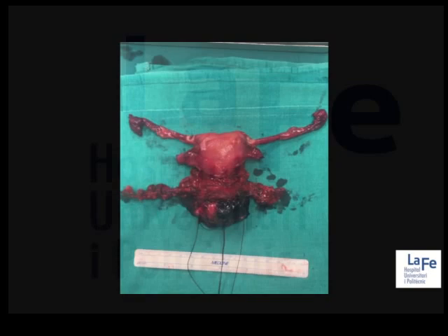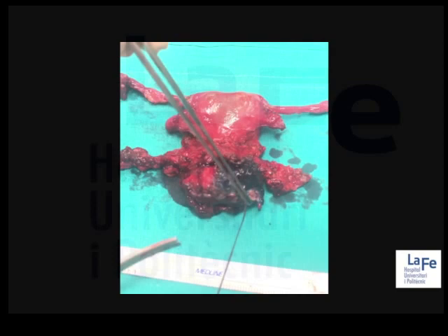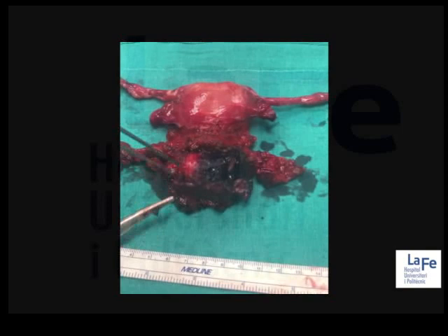This is the final view of the surgical specimen. After removing the running suture, the protective effect of the vaginal cuff can be appreciated.